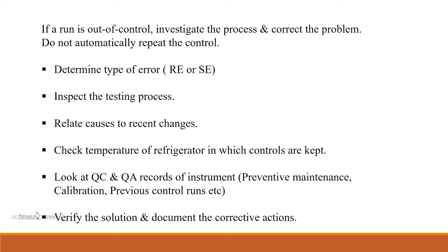If a run is out of control: investigate the process and correct the problem. Do not automatically repeat the control. Determine the type of error — random or systematic. Inspect the testing process and relate causes to recent changes. Check the temperature of the refrigerator in which controls are kept, as every control is temperature sensitive, with specific storage instructions on the control batch. Look at QC and QA records of the instrument — preventive maintenance, calibration, previous control runs, etc. Verify the solution and document the corrective actions.